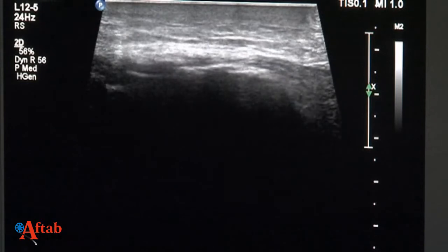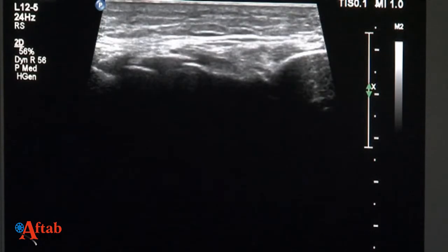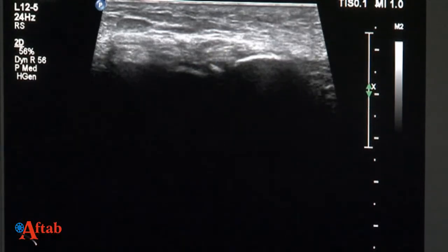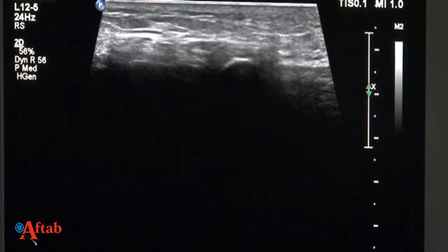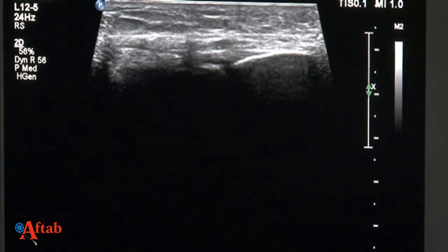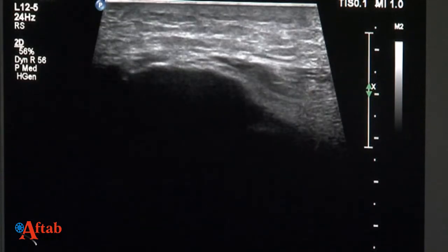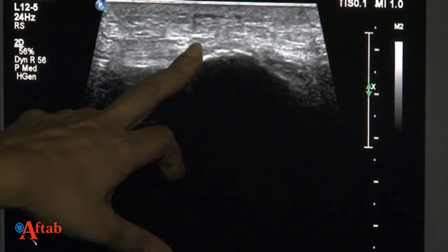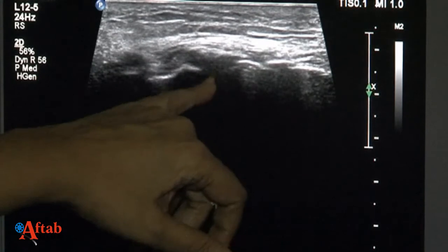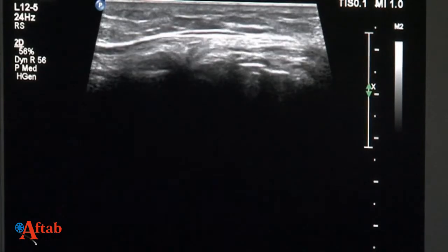So he is continuously pointing to the prepatellar region. Along with, if I go posteriorly, this is the insertion of the long head of the biceps tendon. There is no tear at this point. Collateral ligament, no tear at this point. And we come to the attachment of the iliotibial band, and he's good on the lateral side also. Cruciate here, popliteus tendon, lateral collateral ligament, which is not showing any tear.